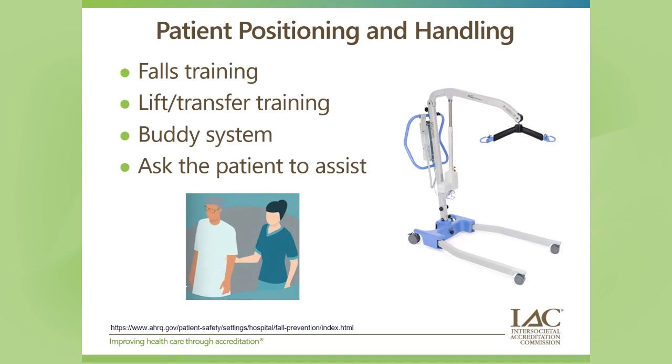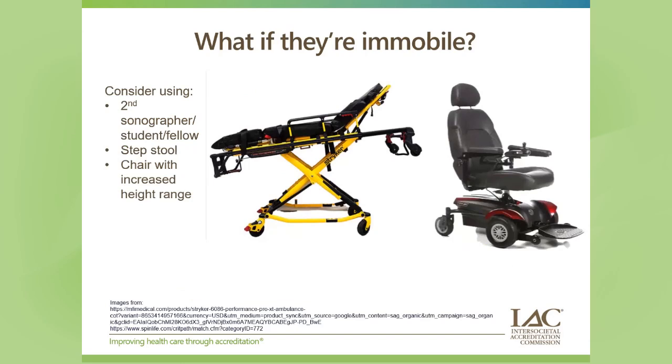And then ask the patient to assist. So if they're able to assist, definitely have them help you out, because it shouldn't fall just on you or you and your buddy. And so there's some great information out there. I think for most of us, in our institutions, there's usually some good education along falls training, and all of this, not only for onboarding, but as part of your annual updates and trainings. But knowing what you have for resources and who's able to help and how the patient can help you is very important.